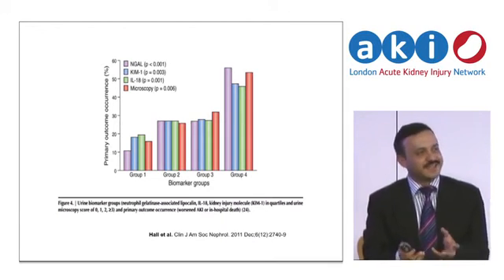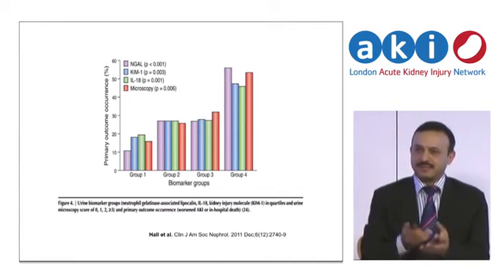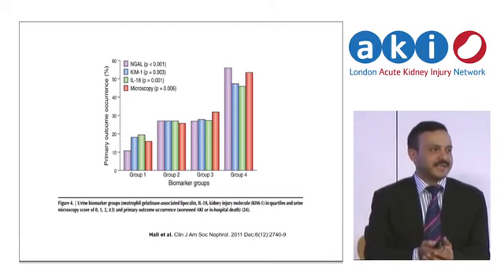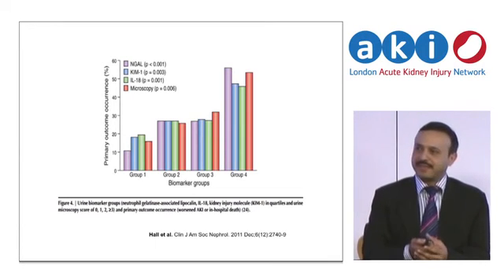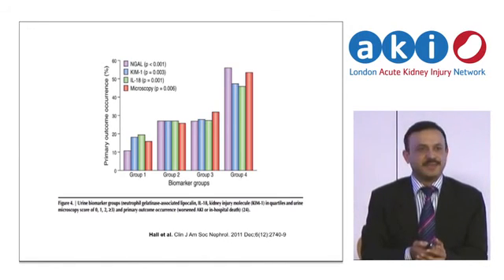And like Hemi said, a lot of things are getting better. I think examination of urine in AKI is also getting better, but whether we are interpreting it as commonly as we are doing it, that's the main challenge.